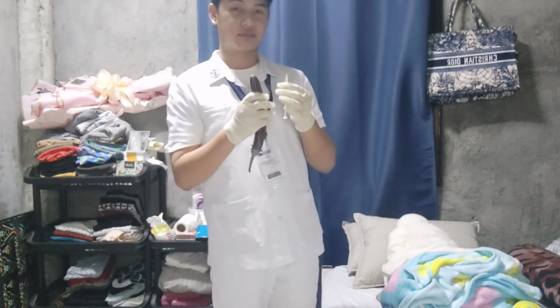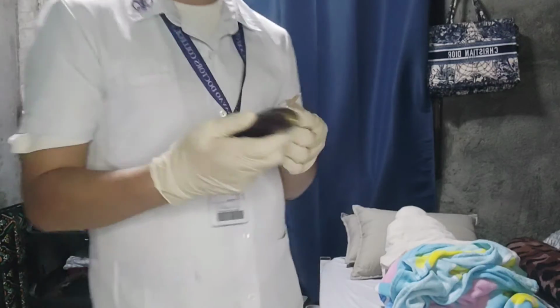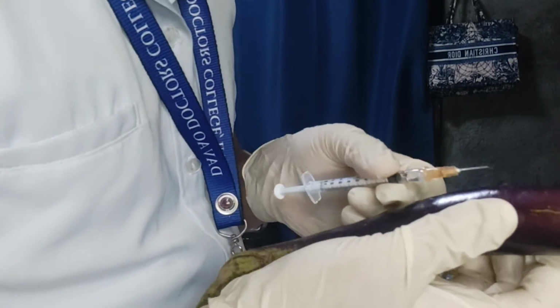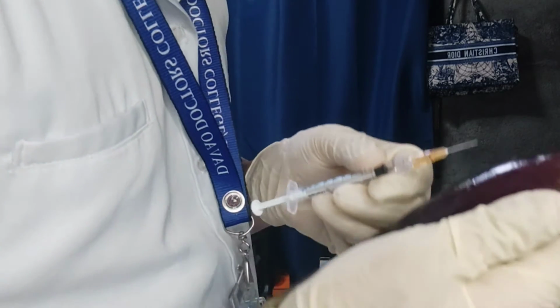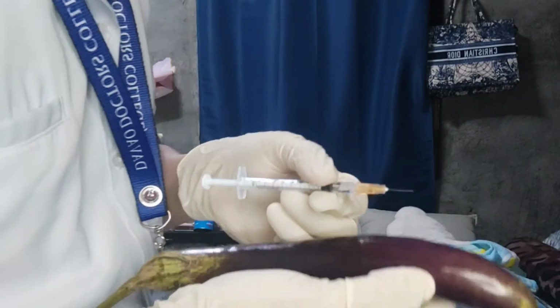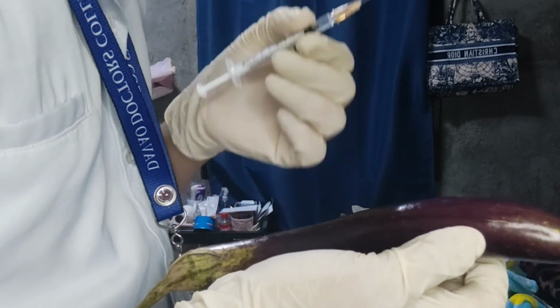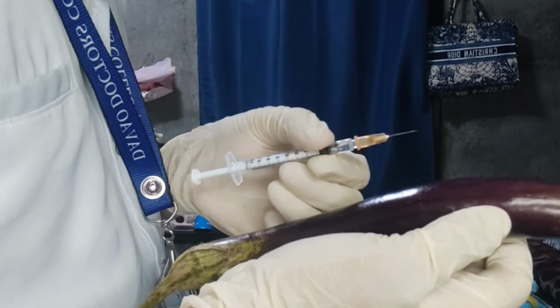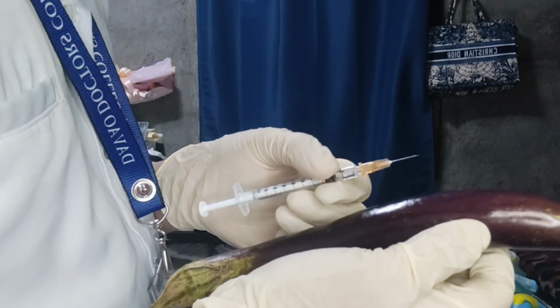After that, we're going to insert like this. At a 15-degree angle, we insert the needle, just only a little bit of the bevel of the needle.